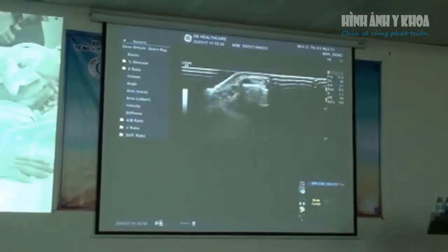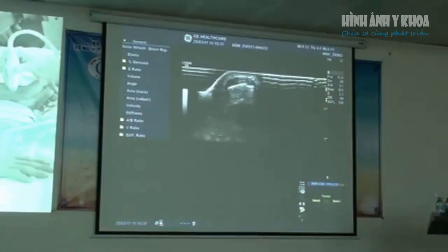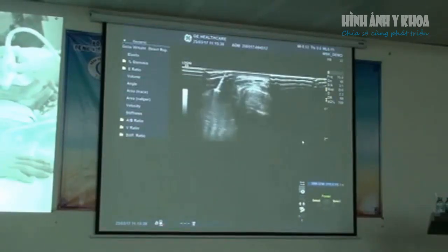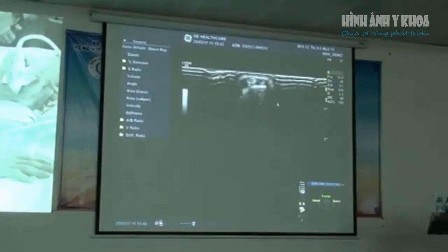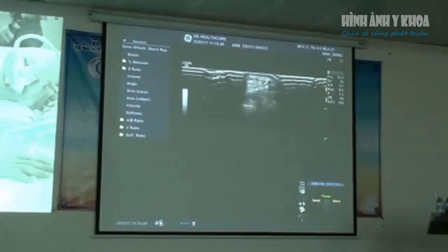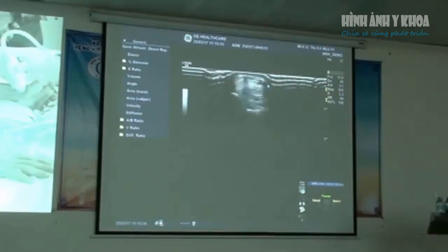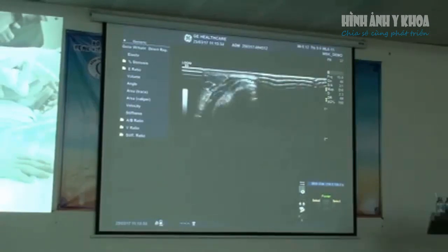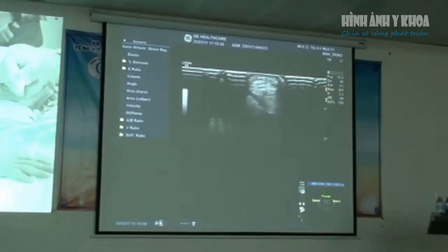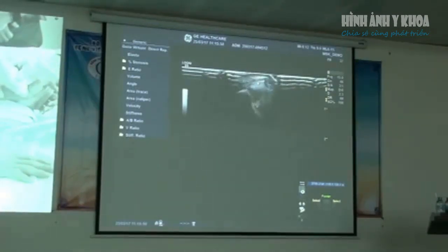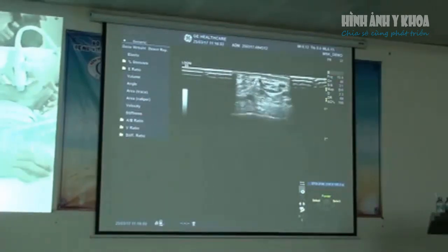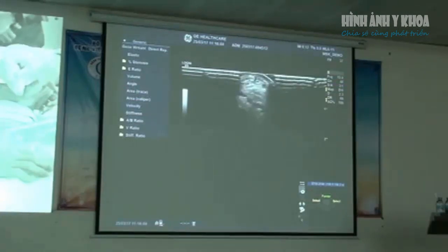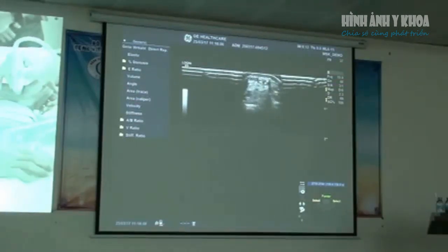This is compartment one. We have just sliding from distal wrist coming down. You can see that they separate at the level of the proximal carpus. We've got EPB going that way and APL over here. The APL inserts under the base of the thumb and it's the thicker of the two tendons.